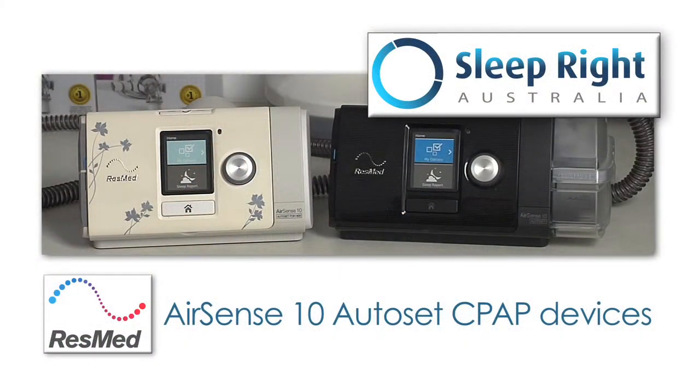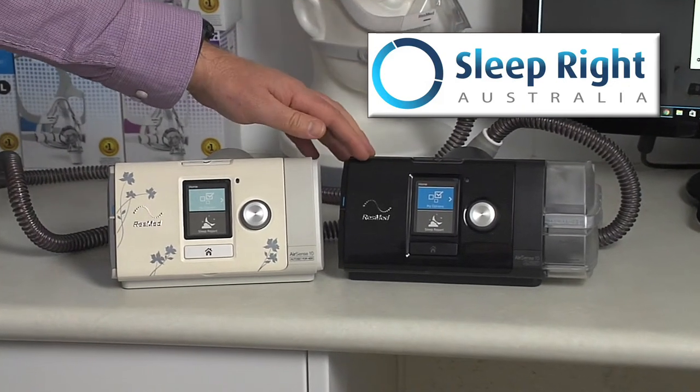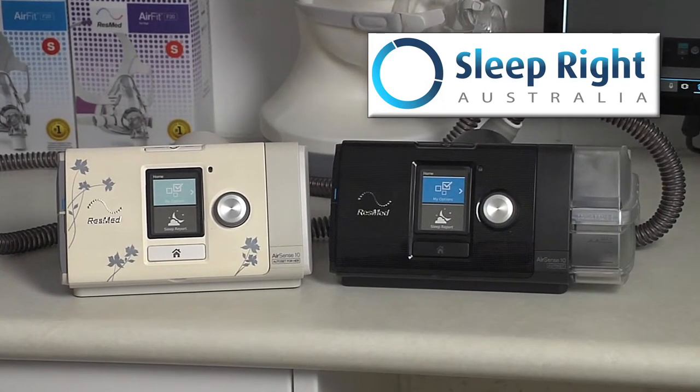Andrew from SleepRite Australia here, and in this video I'm going to talk to you about the ResMed AirSense 10 devices. The ResMed AirSense 10 devices come in AutoSet, AutoSet for Her, and also in the Elite fixed pressure version.